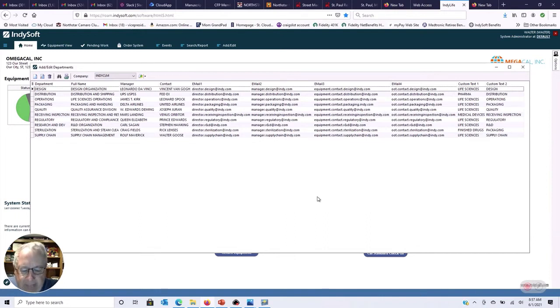Additionally, we used Screen 4, which, if you recall, was where we had all those custom fields. We took advantage of the top two custom fields to identify the business unit for the department and the division within the business unit. At Medtronic, we had over 5 different businesses that we supported, and within those businesses was further segmented by 15 to 20 divisions. So by utilizing the custom fields, we could further segment our alarm reports as necessary to be the most effective.